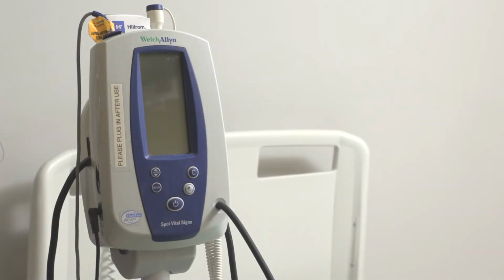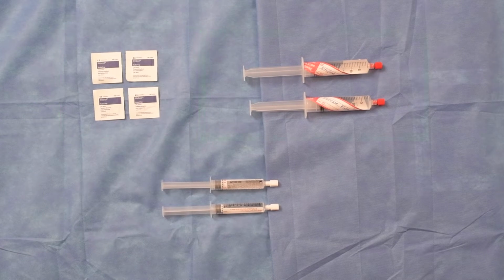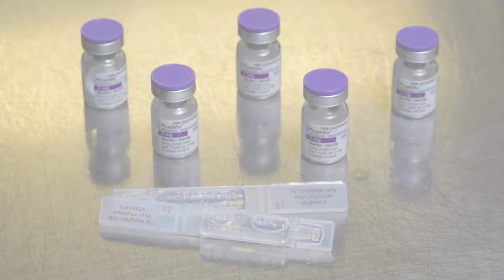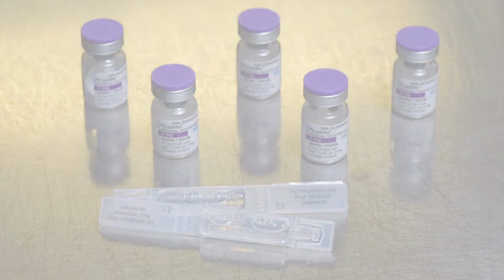You will need the following: equipment to take vital signs, 4 alcohol swabs, prepared syringe of Alteplase, prepared syringe of dornase, 2 prepared syringes of 10 mL of sterile normal saline. Refer to the procedure for reconstitution of medications as needed.